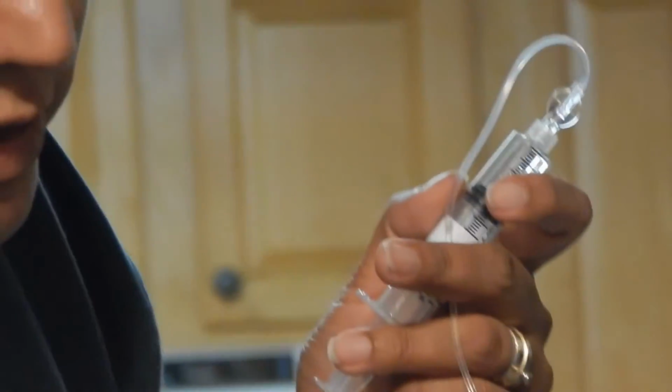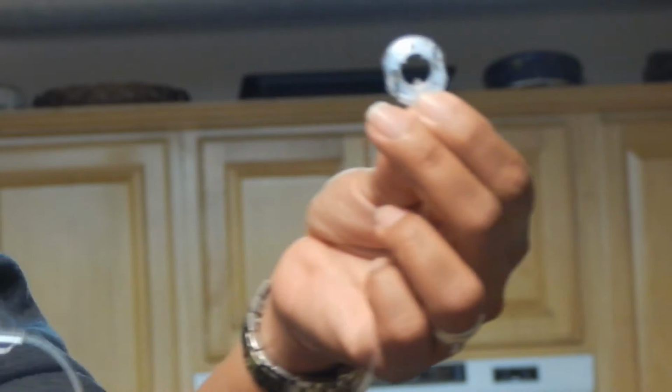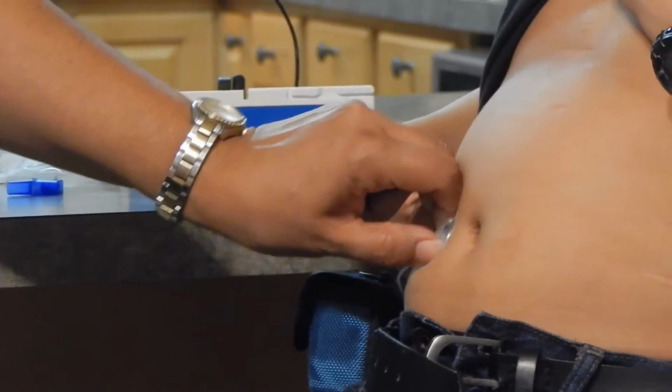So, before we connect it, we have to unscrew it counterclockwise. Then we have to take out as many bubbles as we can. We have to make sure it's not clogged, and to take out as many bubbles without taking out as much medicine. When you push a little bit from the syringe, a bubble comes out, and it's right there. So now we can plug it back in, connect it right, and then spin it clockwise so that it connects to that line right there.